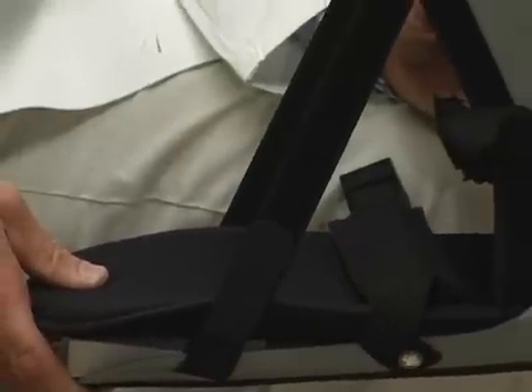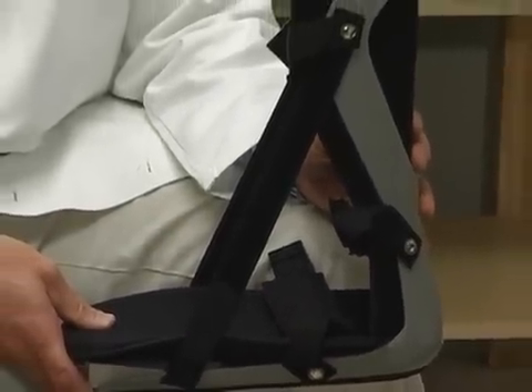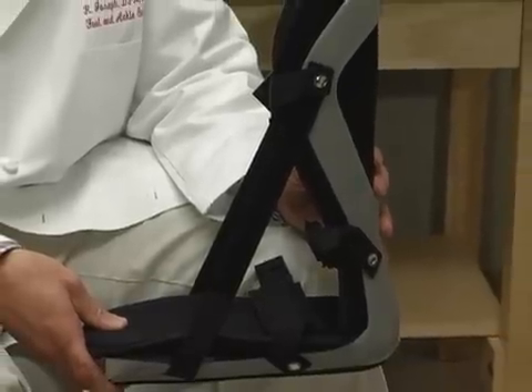One of the things that we use to help improve ankle range of motion is a night splint. A night splint holds the foot at 90 degrees to the leg, preventing contracture and helping to maintain range of motion in the ankle.